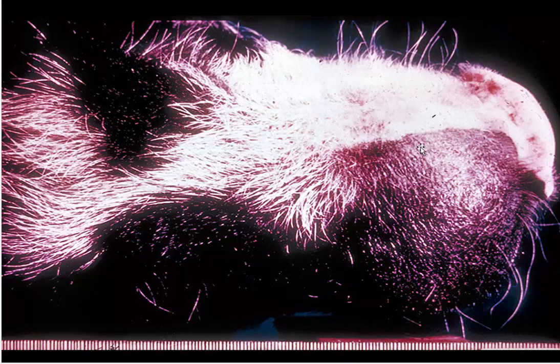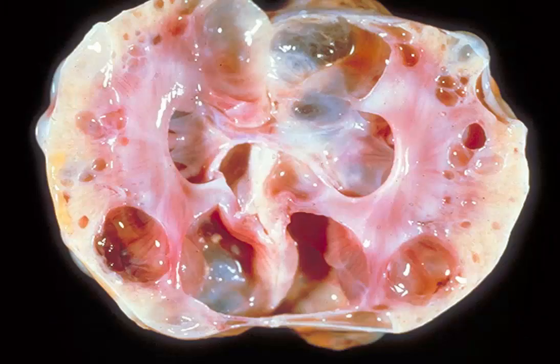You're not going to mistake this for atrophic rhinitis, which in itself may cause deviation of the snout or a wrinkling effect. This is very proliferative, very nasty looking and nasty smelling. Bull nose in pigs. Slide number 9 is tissue from a cat.